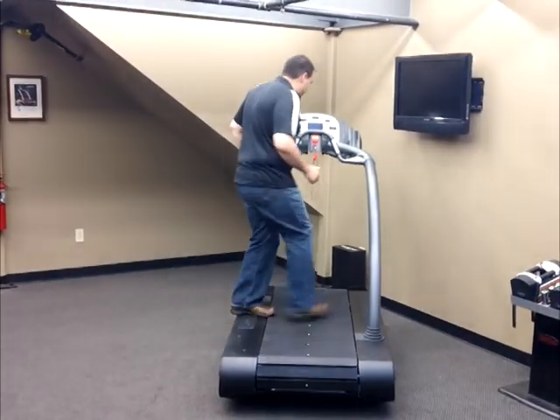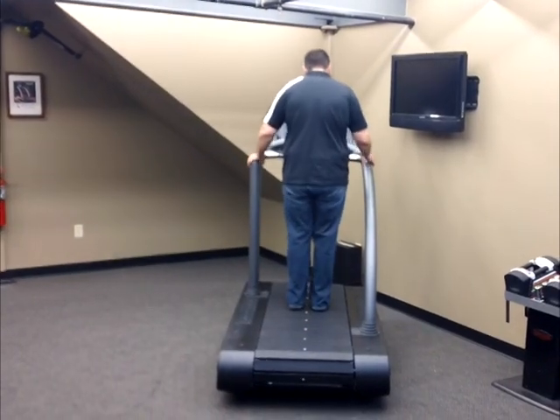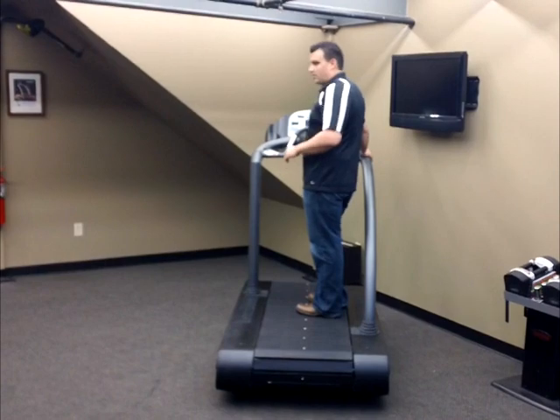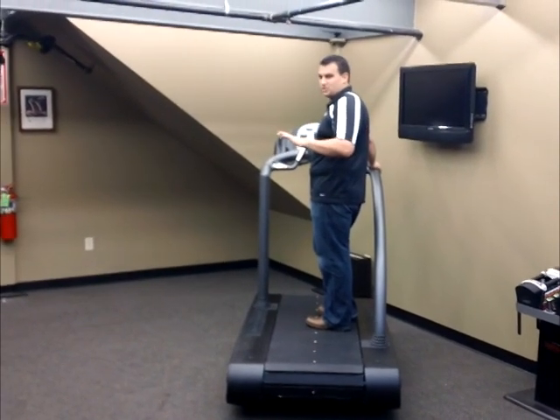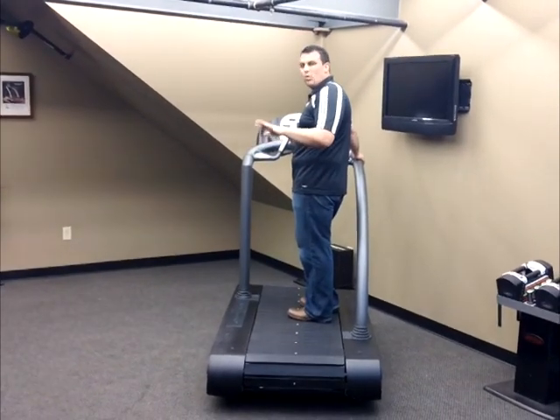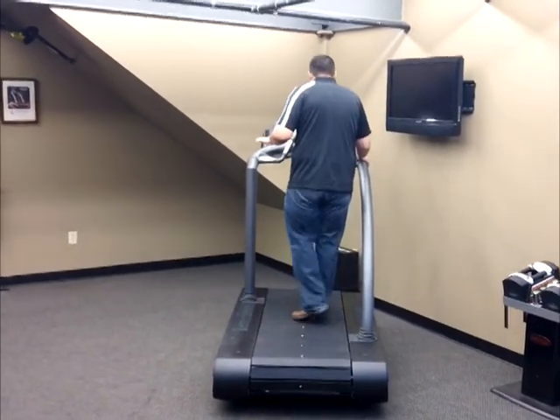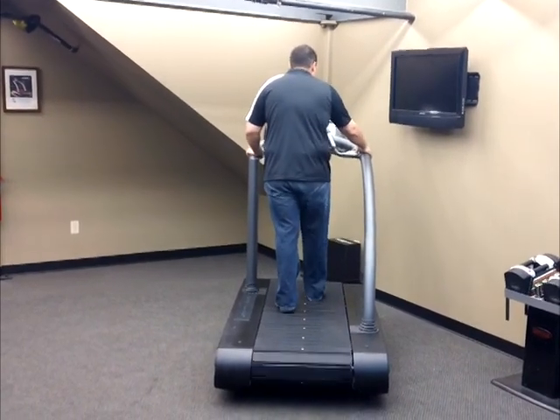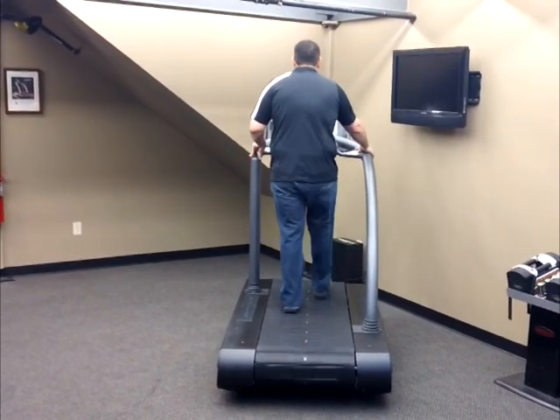I'll step up here and take my position. The Woodway Treadmill, because of its belt design, also has a true zero start. I'm standing at it going from zero, and I'm going to go up in .1 increments.